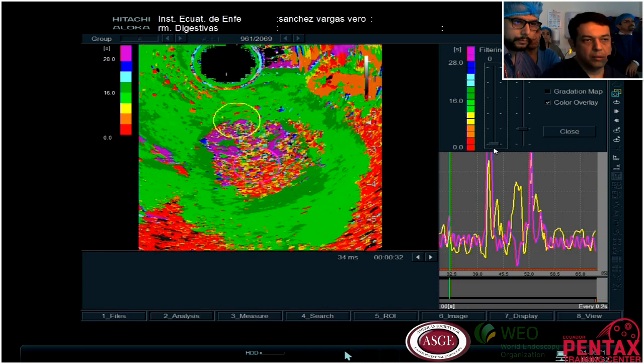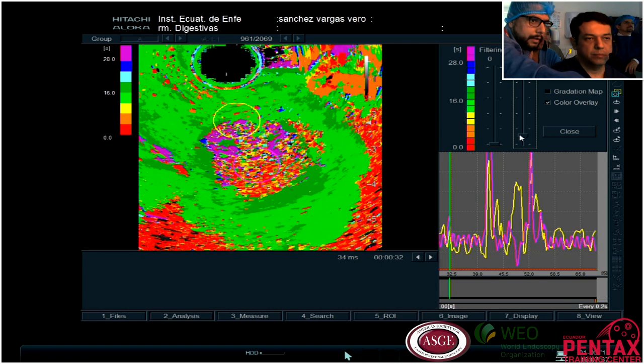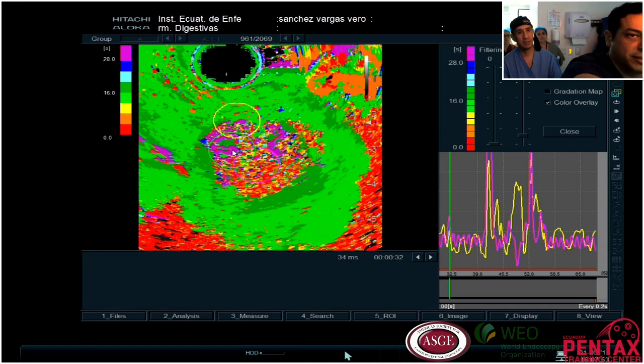Now it's better. So we can see here the difference in the colors. You see from the green to the blue, and how do you say this color in English? Violet. So violet is the higher captation, and that's good because we can see that probably there's some inflammatory area. So yes, we can graph that.